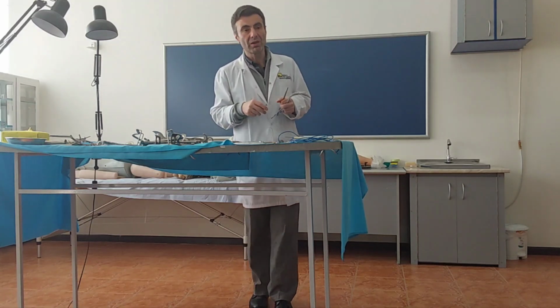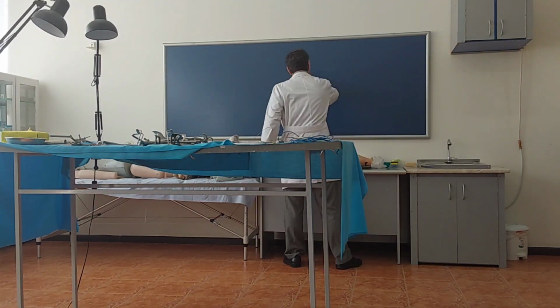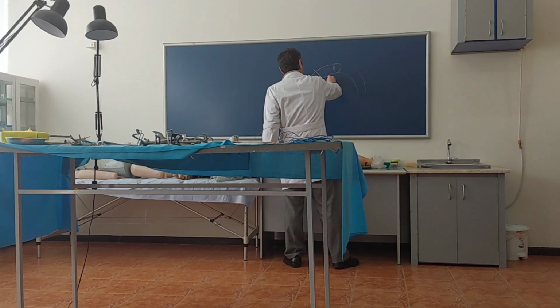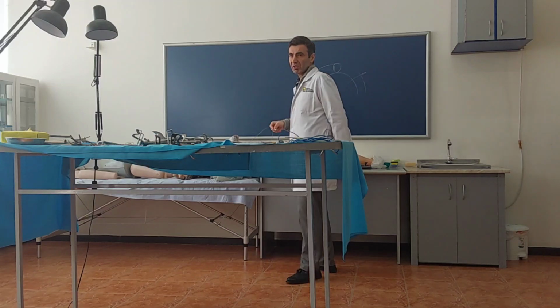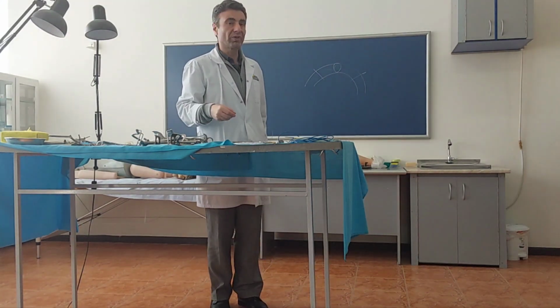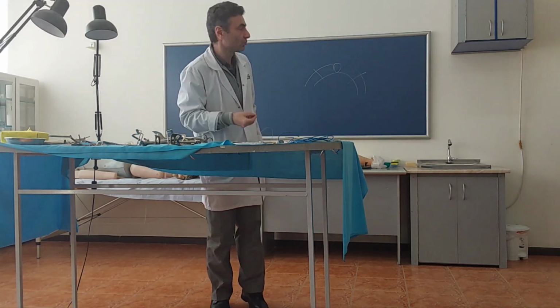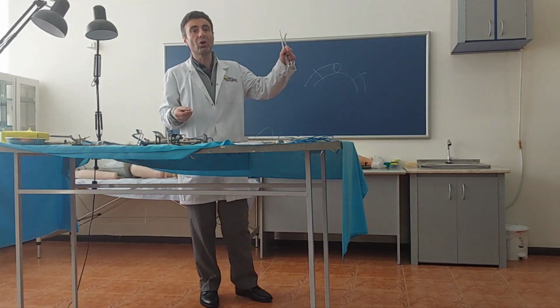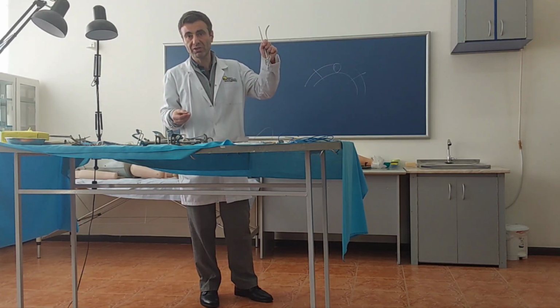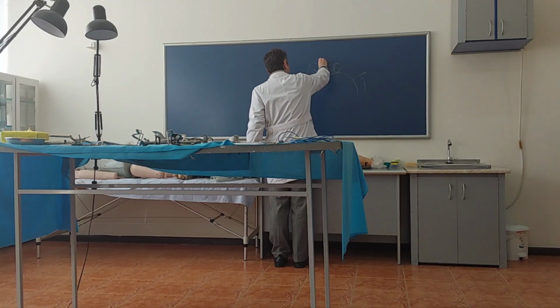What is the function of each one? Now look, listen. Imagine that you should remove part of the intestine, because there are some problems here. For example, tumor. In this level, I must remove the intestine. Yeah, we call this surgery resection. Portion of removing of the organs we call resections, as you remember. I must use 4 such kind of instruments for this surgery. 1, 2, 3, 4.